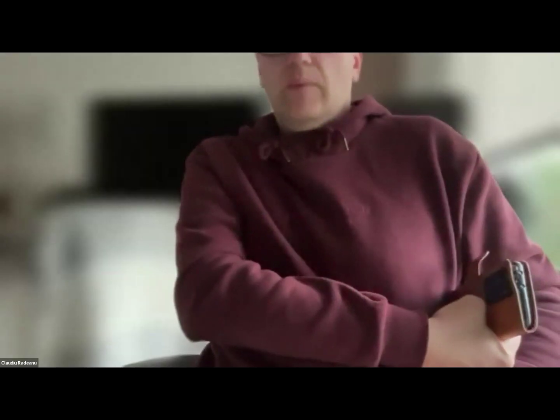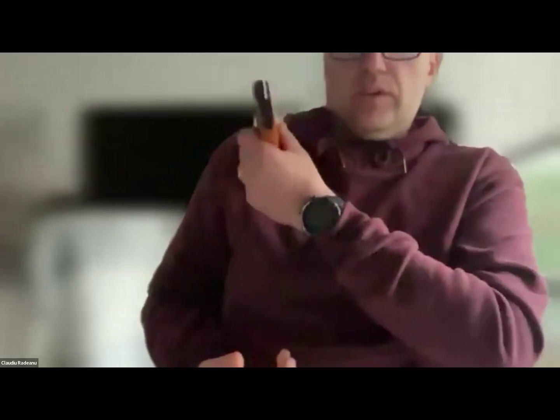I put it transverse, so I have 2 ribs in view, and I keep moving like this and then keep going down. Sometimes you can slant along different ribs. And then you go onto the other side and do the same.